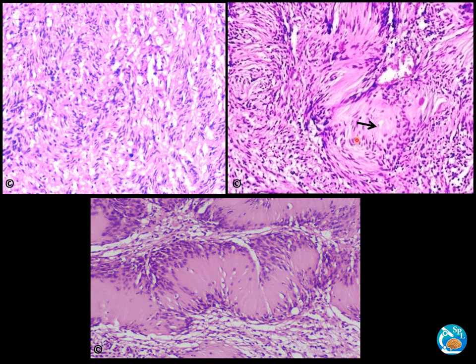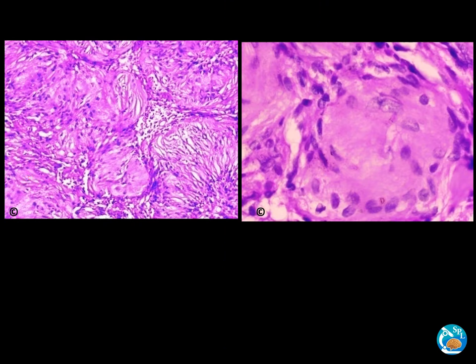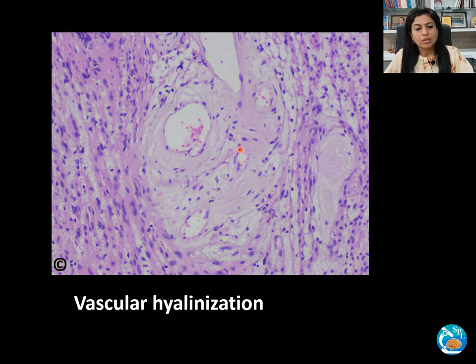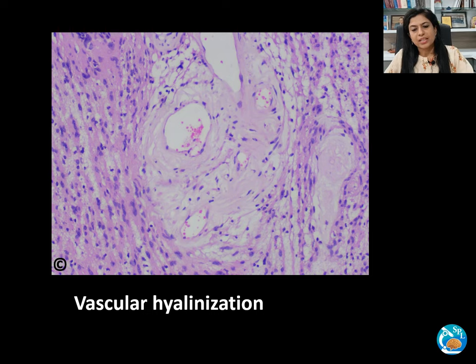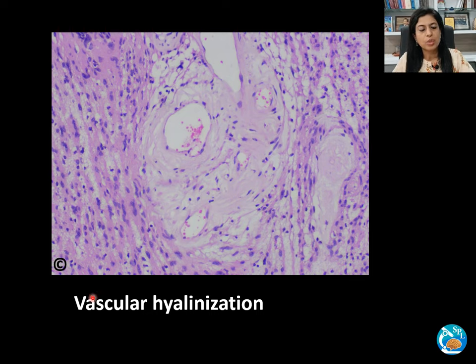These are the Verocay bodies. You can see the Verocay bodies here — these are acellular masses. A Verocay body is composed of central acellular fibrillary material. The tumor also showed vascular hyalinization, and there were inflammatory infiltrates such as lymphocytes and plasma cells, and foci of hemorrhages were also noted.